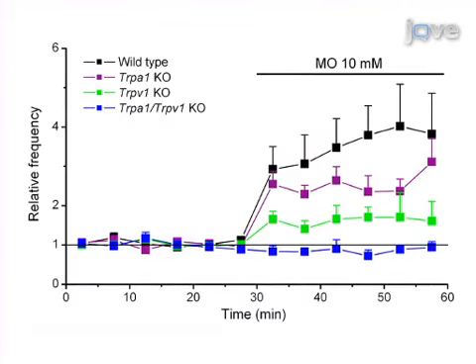The average instantaneous voiding frequency before and during intravesical infusion of MO supports these data. The average frequency is relative to a saline infusion.